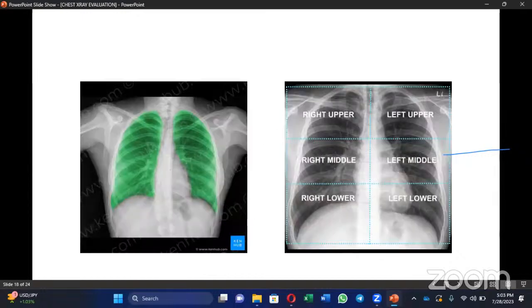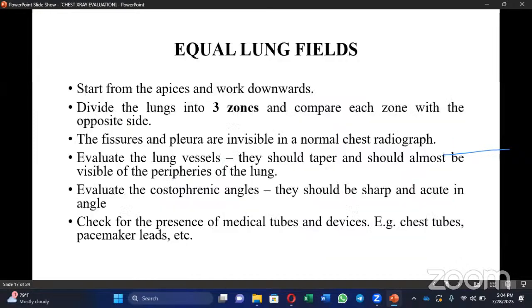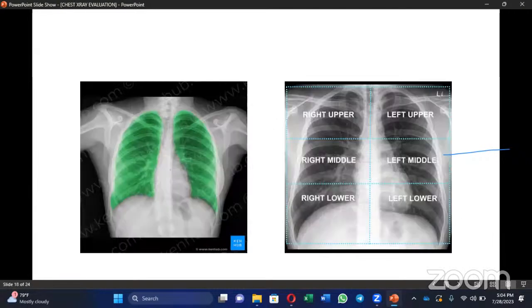Those who use lobes are the senior men, because it is very difficult and you can confuse the position of a pathology within a lobe with other lobes, which is not acceptable. So in order to free ourselves from all the confusion that comes with the lobes, we use the zones to do our positioning of the pathologies.